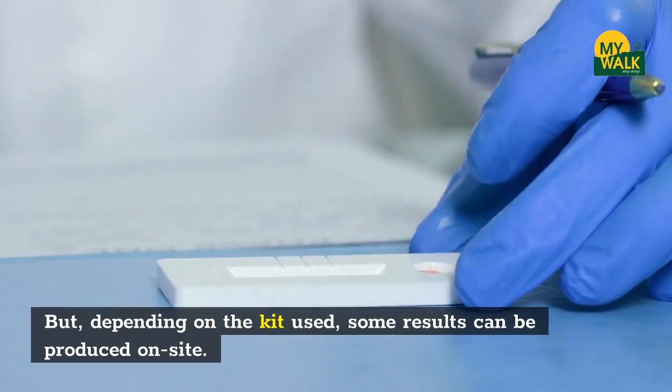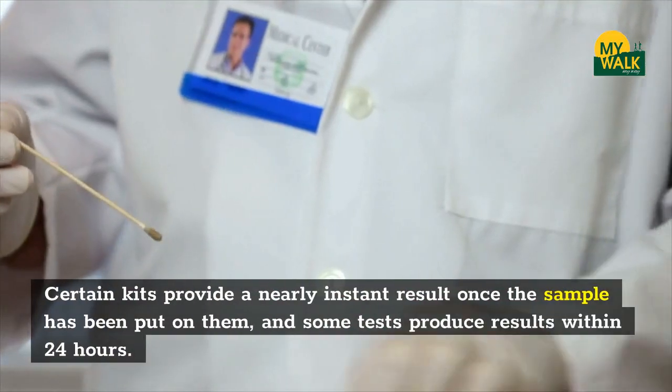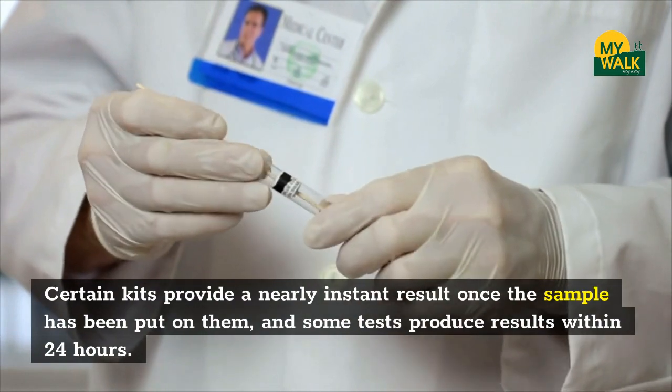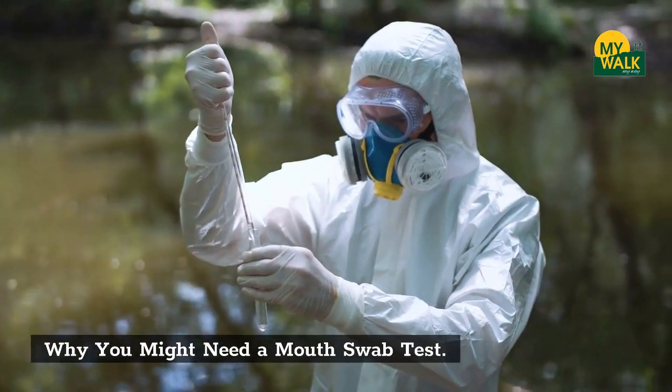But, depending on the kit used, some results can be produced on site. Certain kits provide a nearly instant result once the sample has been put on them, and some tests produce results within 24 hours.